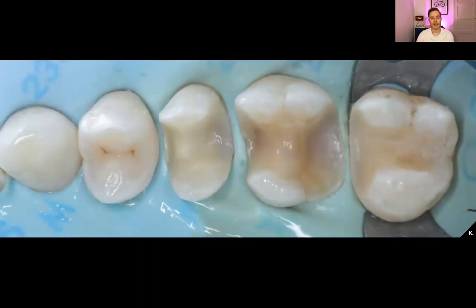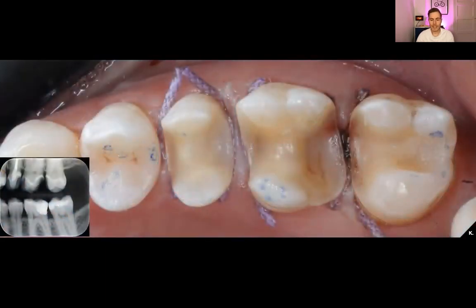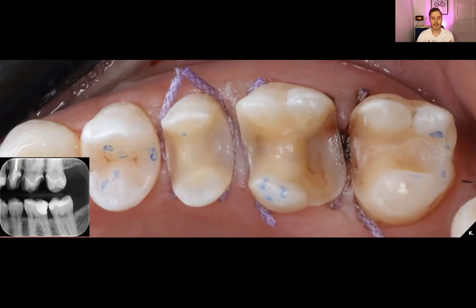This is what the entire situation looks like after the appointment and after the deep margin elevation. Initially I had two hours, and since it was a pretty hard case I decided to work through my lunch break — overall it took me three hours to complete this case. So what I did was three deep margin elevations and one direct restoration in three hours, and this is what it looks like just before impression taking. The margins are raised but I still need some retraction cord to make sure that my outline is properly captured in the impression.